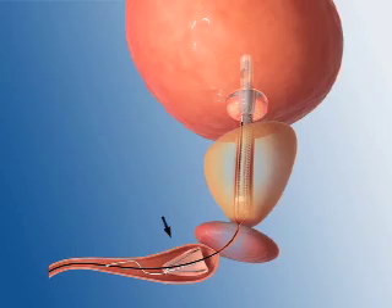There is a soft silicone anchor which is seated in the bulbar urethra. This anchor is attached to the stent using small diameter tethers which traverse the external sphincter and allow the patient to remain continent. This anchor prevents device migration into the bladder.